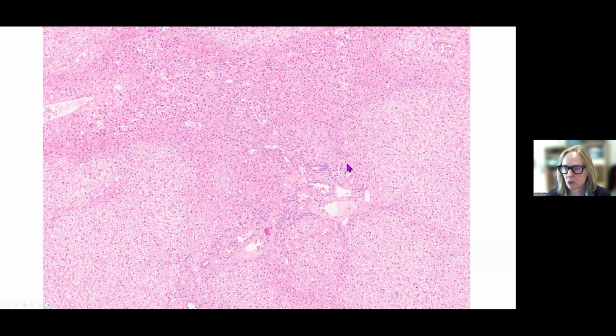But then we have got this structure, which I think we can't argue is very portal tract-like, let alone pseudo-portal tract. So we've got a mixture of unaccompanied arteries and structures where we can't be 100% certain if that is portal or not. And then the other thing in terms of the cells themselves: more eosinophilic, paler.